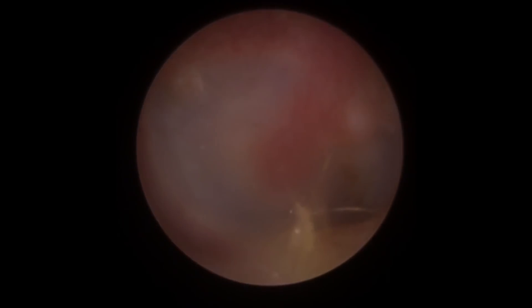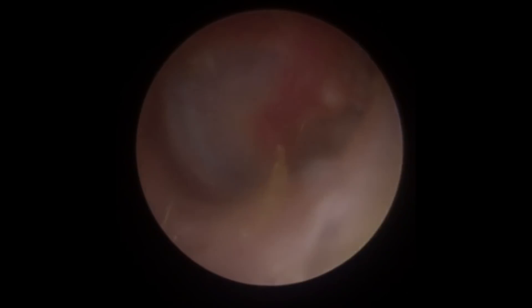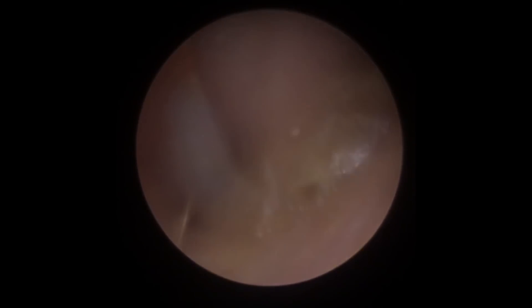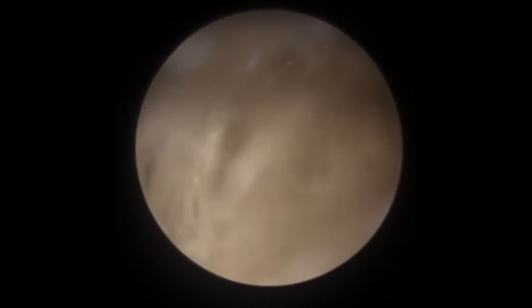Let's get a good grip there and out it comes. You can see all the white underneath — that was the dry dead skin. You can see just how much hair was on the outer part of this ear canal as well. There's a little lift of dry skin there at the base of the canal, so we're going to use a little bit of suction to try and lift this off. Just battling our way through the little hairs on the outer part of the ear canal. You can see that whole section lifted up there — difficult to get a good grip on this now because it's very thin. We've got the forceps out already so we'll just get a grip on this section and pull. There we go — that bit's gone as well.